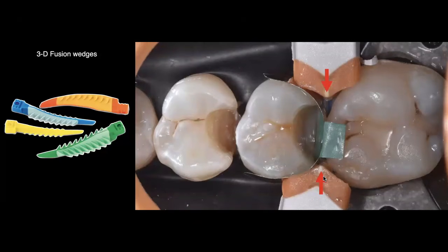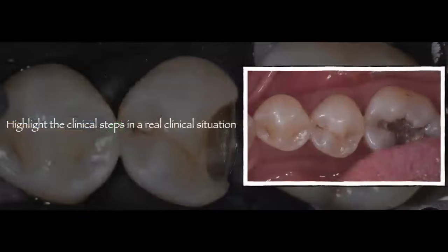That double contour that the 3D band has is kept because this wedge has these little spikes that are made out of rubber. They're very, very soft, and they're only meant to adapt the band. They're not meant to deform the band, because you are going to get that interproximal contact tightness given by the additional force of the ring on top, in the buccal and the lingual embrasures, as you are seeing here in this photo. So it's a combination of all these things that give you that ideal interproximal contact tightness.